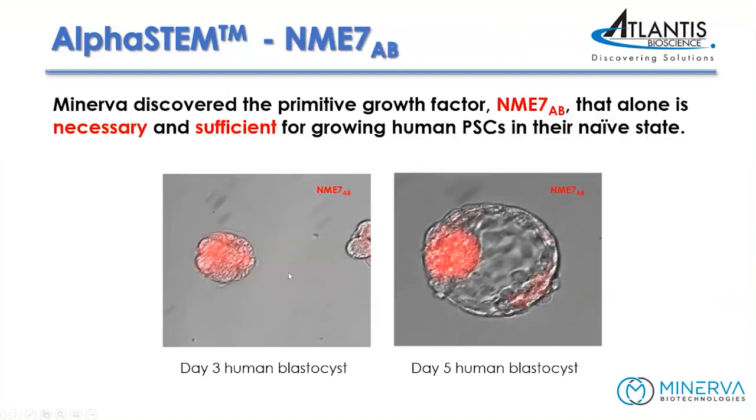So now let's take a closer look at this culture media. This culture system was developed by Minerva Biotechnologies, a company in the United States that works on cancer and stem cell therapeutics. This system is serum-free, feeder-free, FGF and TGF-beta-free, and it does not require the use of any inhibitors at all.